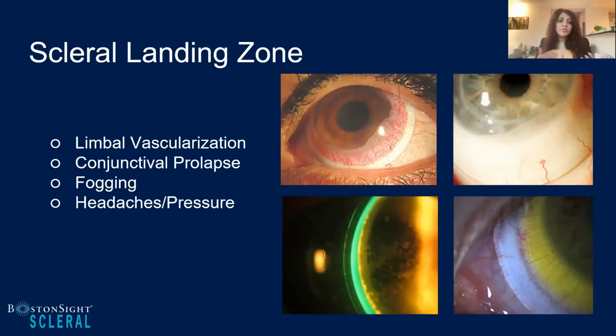And if that first visit when you see them is after they've been wearing that lens for 4 hours, and you're not sure if you're going to continue to get more settling, have a later appointment with them where they've been wearing the lens for 6 to 8 hours so you really can see what that lens looks like, because that tightness around that edge, you really need to be able to catch, and you want to catch that during your warranty period so you can fix all those changes before you give them this lens for the next year to take home.